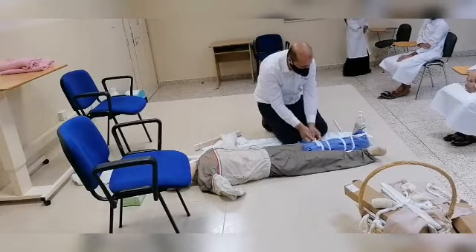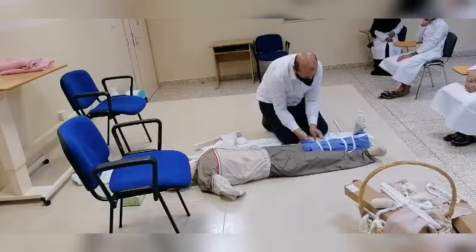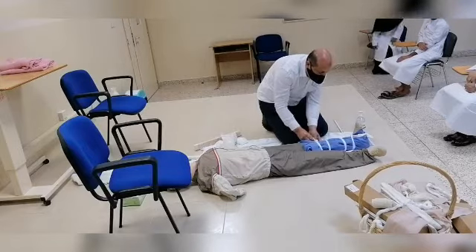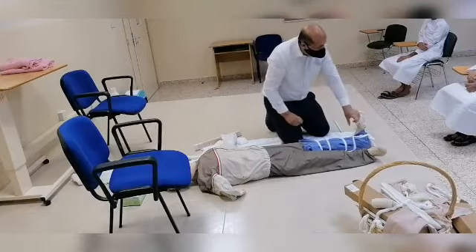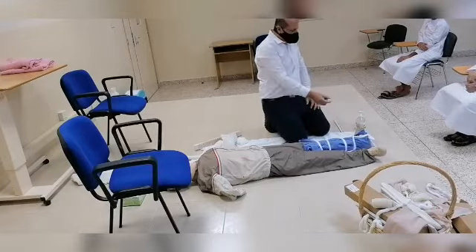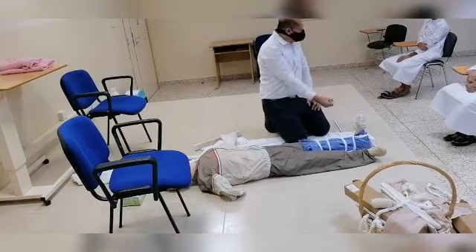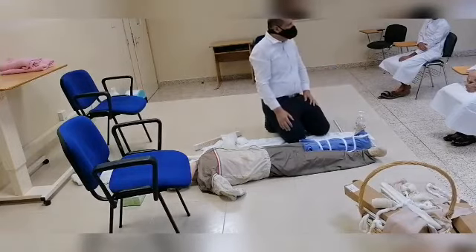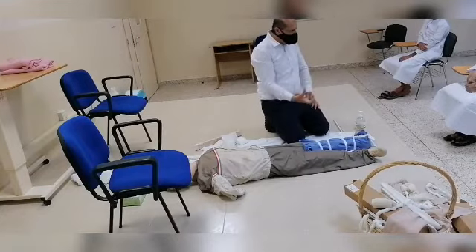Then I will go back to the first binder and fix it properly. Now the leg is fixed. After that I have to check the circulation by asking the patient if he has any numbness, and if he can move his toes. The limb can be elevated while we transfer him. We can also use cold compresses to prevent swelling and reduce pain.